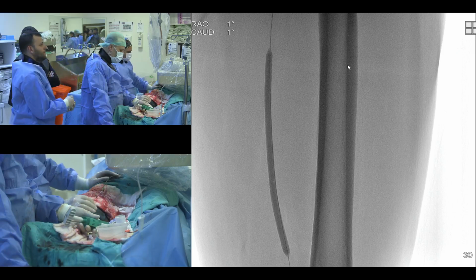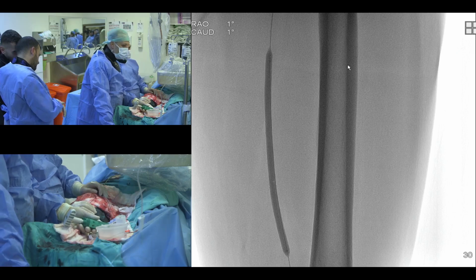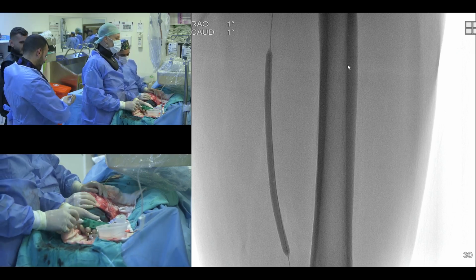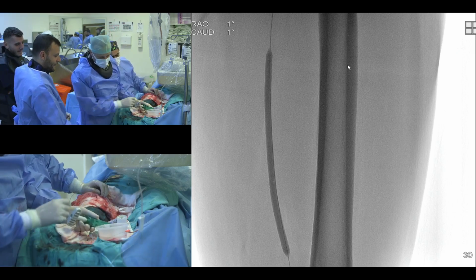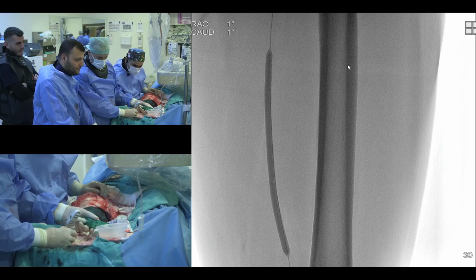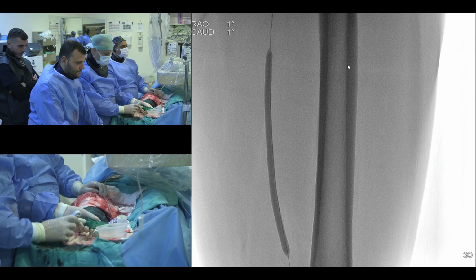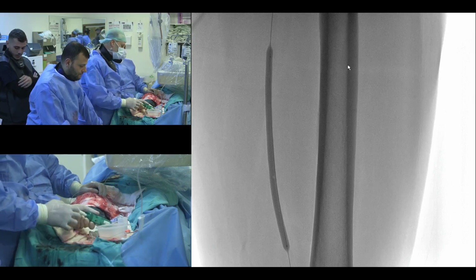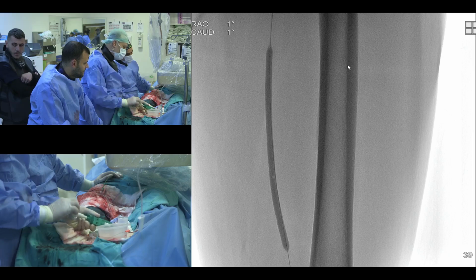Okay. We may be in the graft now, I think. That image may be related with an occluded graft, or an occluded native artery. But I think we are either in an occluded graft with subintimal passage, or extravascular.